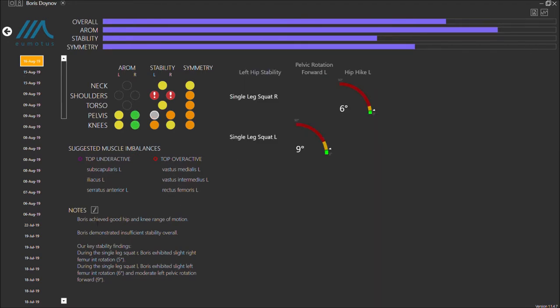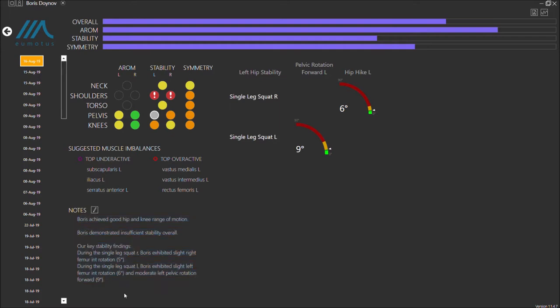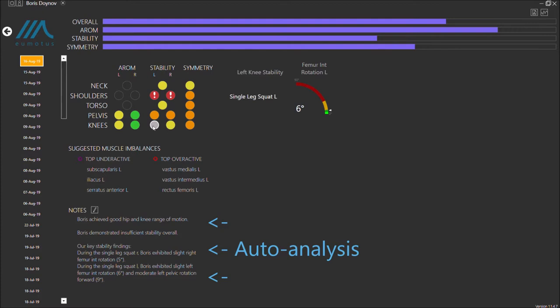Now, we know it can be hard to process all the data that our system produces, so that's why we've created the Auto-Analysis. Our Auto-Analysis will produce an easy-to-understand paragraph about the key takeaways for a given movement.